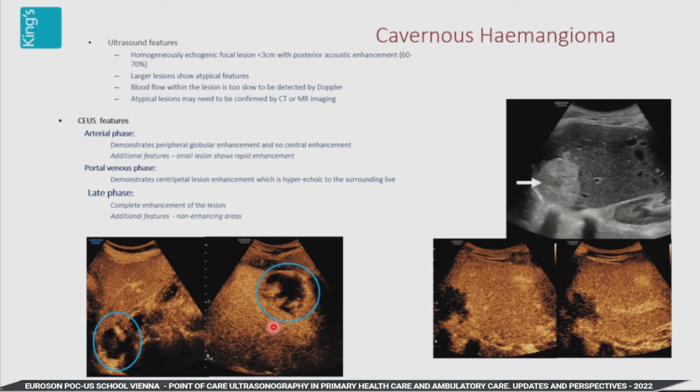Whereas if you're looking at the CT or the MR, you are presented with an image by the technician at the time he or she thinks it's most appropriate to make that image and give it to you. So you are making an interpretation on one image, that you're not seeing all of it.